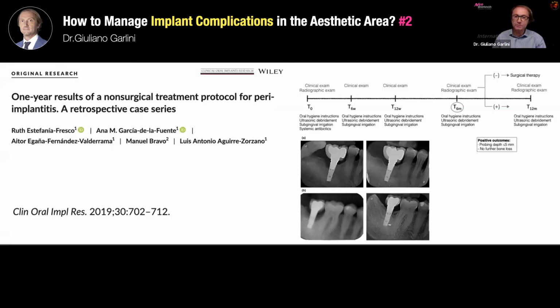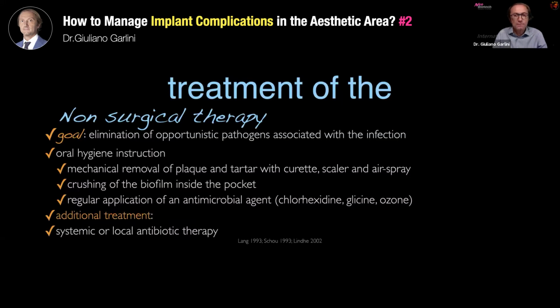So let's now consider the treatment of peri-implantitis. First of all, we must say that we can have different approaches to peri-implantitis.